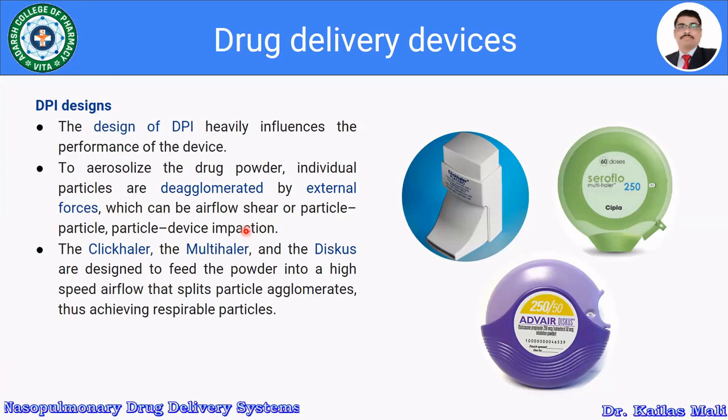There are a few designs which are available, that is the Clickhaler, the Multihaler, and the Diskus. These are designed to feed the powder into a high speed airflow that splits particle agglomerates and thus achieves respirable particles.